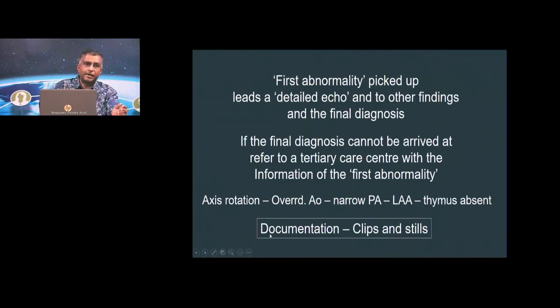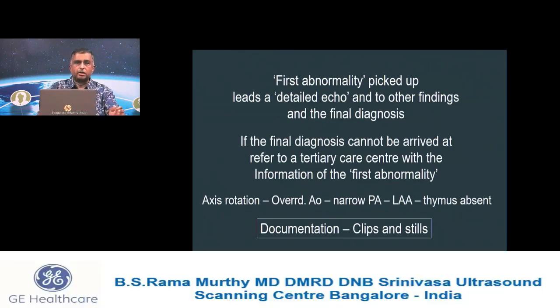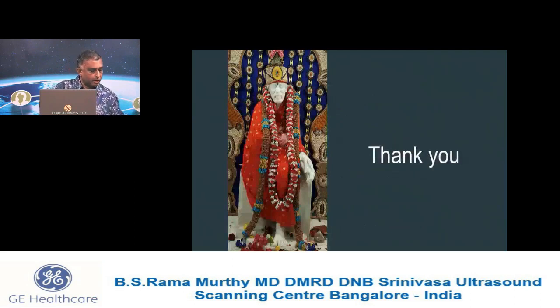And what is boxed is extremely important: documentation. You have to document clips in every heart that you see, normal or abnormal. You've got to document stills, normal or abnormal. Remember, it's extremely important to do this. So with this, I take leave of you as far as the presentation goes.